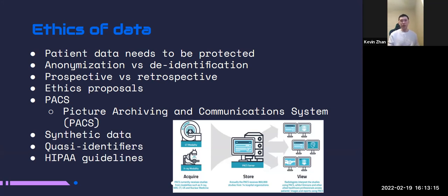So we only have the image to work with, and that's what we'll give to the ML technician. Comparatively, de-identification is where we don't necessarily delete that information, but we obscure it. So we have a list somewhere, maybe in a secure server, that says, this is patient one, which has been redacted when we're working with, and we can get that information if we choose to need it.